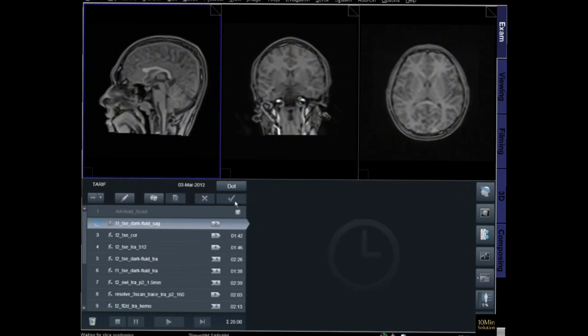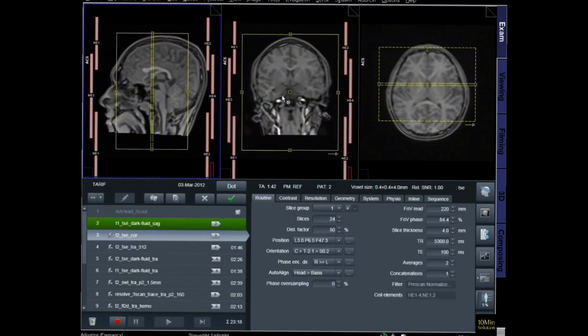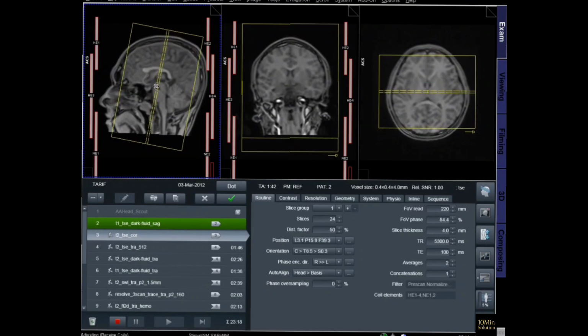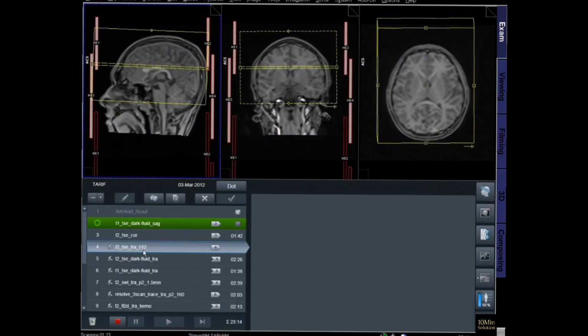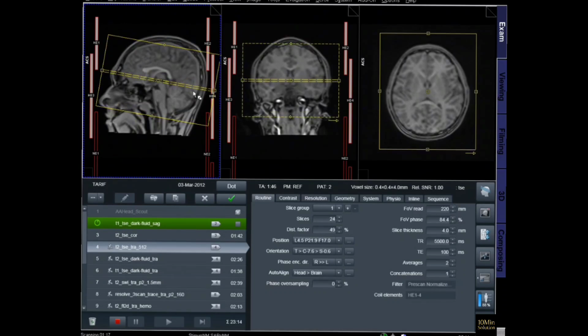Compared to a routine brain MRI, the epilepsy protocol is more detailed and focuses particularly on the temporal lobes and hippocampus. Patient preparation. Before the examination, a detailed clinical history is obtained, including seizure type, duration of symptoms, and medication history. If contrast is planned, renal function must be evaluated because a gadolinium-based contrast agent is typically used.